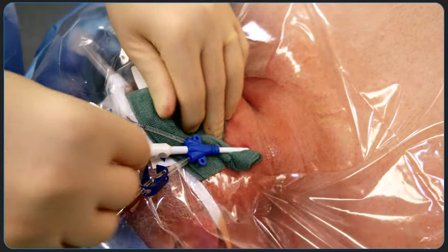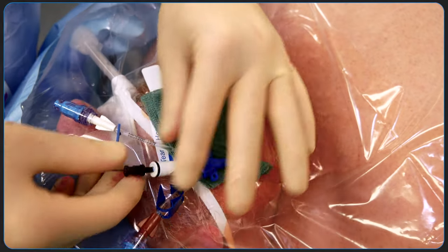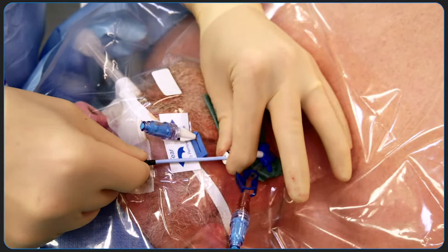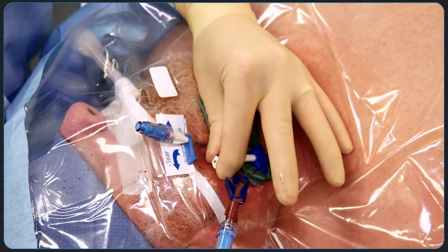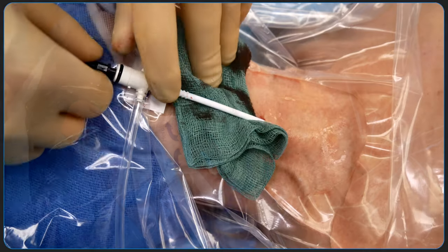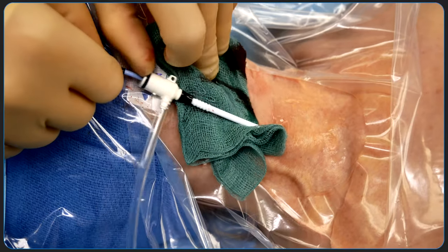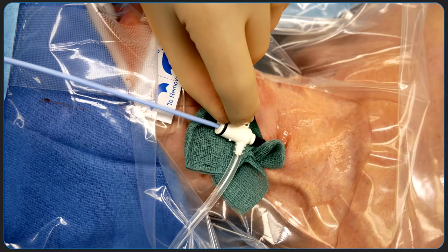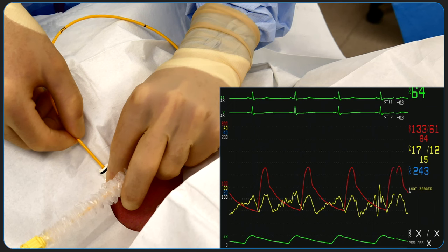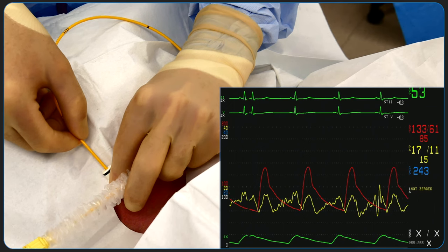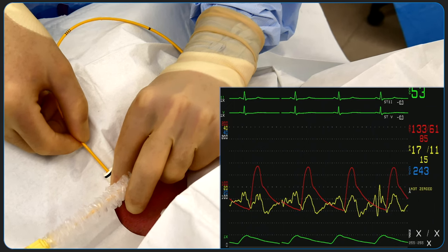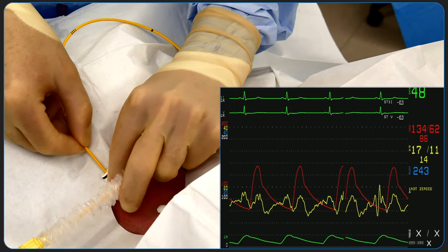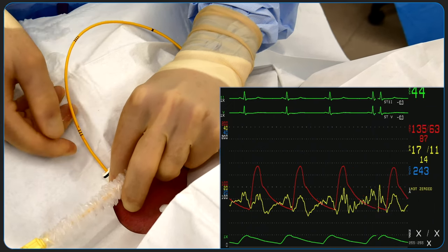In this video, we'll be demonstrating insertion of a multi-lumen access catheter or MAC introducer and percutaneous sheath introducer or PSI, in addition to flotation of a pulmonary artery or Swan-Ganz catheter, in an intubated patient under positive pressure ventilation.